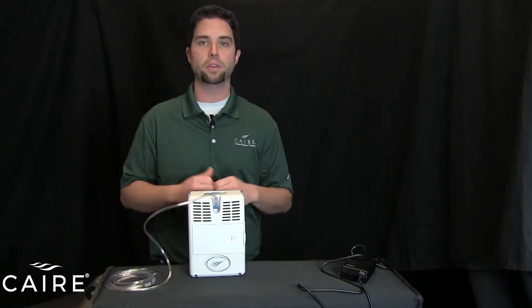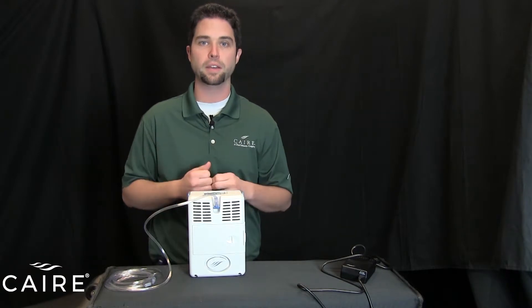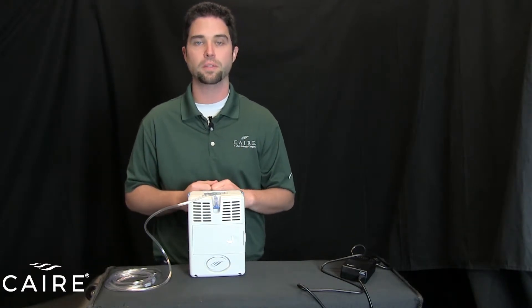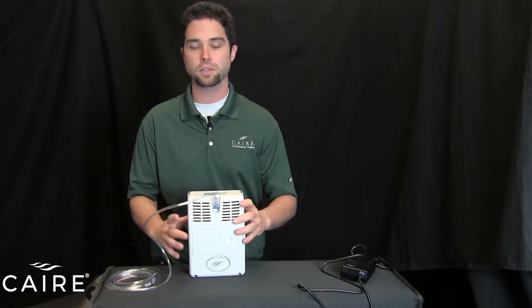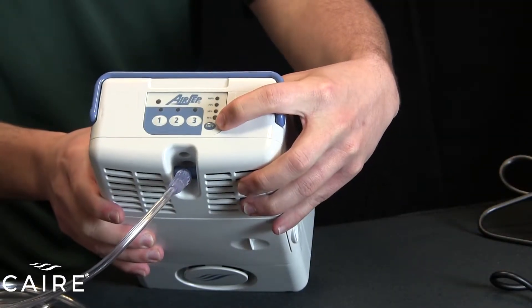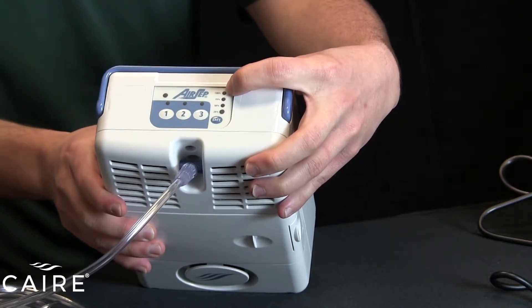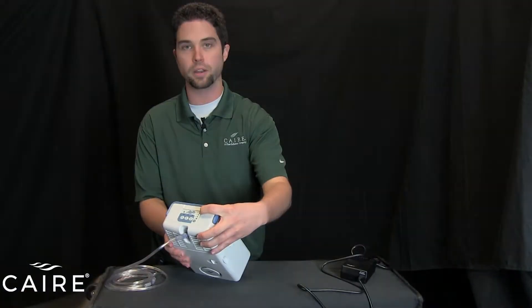Once that's connected, you're ready to power the unit on. But before you do that, it's always important to check and be sure that your battery has charge in it. To check if your battery has charge, there's a button on top of the unit — B-A-T-T for battery. When you push this, there are four lights, 25 up to 100%, that will light up and show you how charged the battery is.